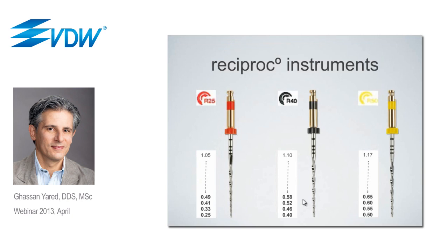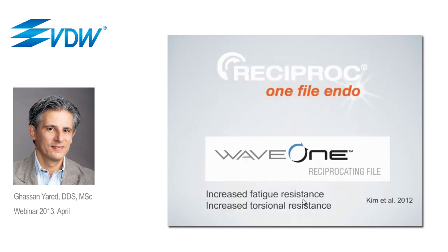Now, as far as I am concerned, I definitely prefer the Reciproc instrument over the WaveOne. The Reciproc instrument is a better instrument for two reasons. First, a glide path is not needed in most of the cases. With WaveOne, a glide path is needed in every case.